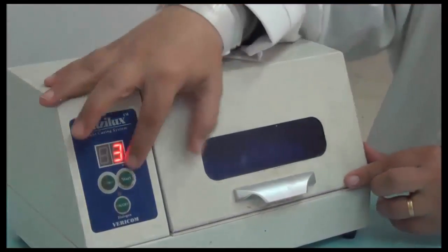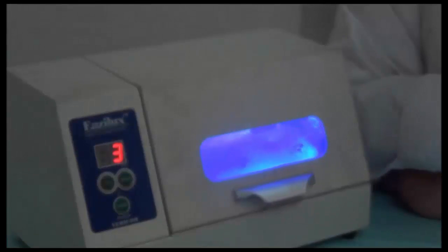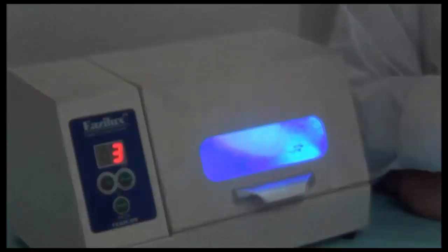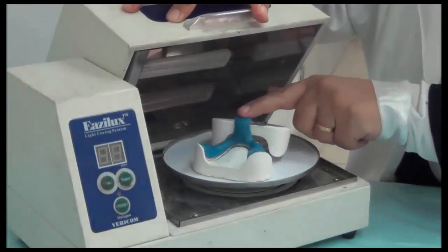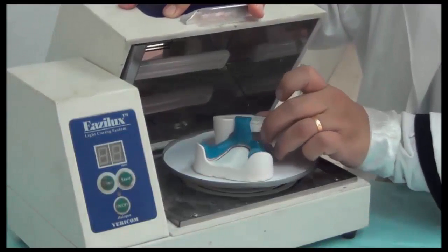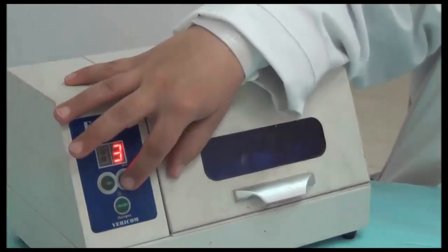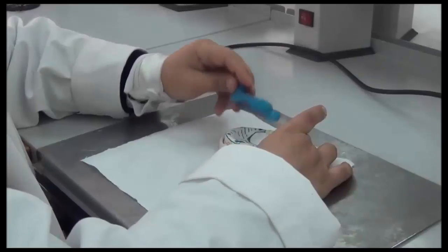The idea, we need to remove the support while it's curing, because the support material will be preventing the light from entering into that area where it's touching. So we need the handle solid enough to take the support away and complete the curing cycle. Once more. Now it's hard enough. I could remove my support material and then cure it fully till it's finished.